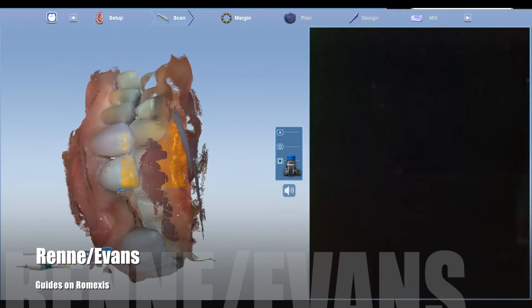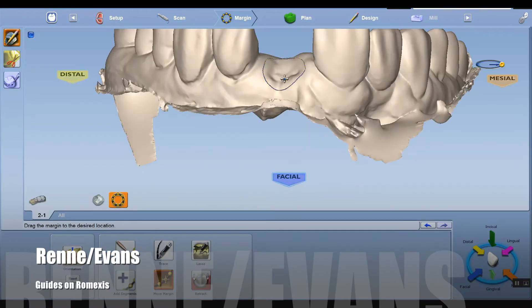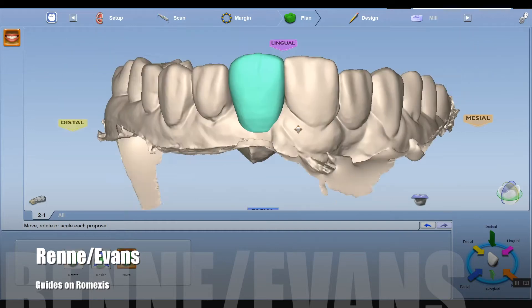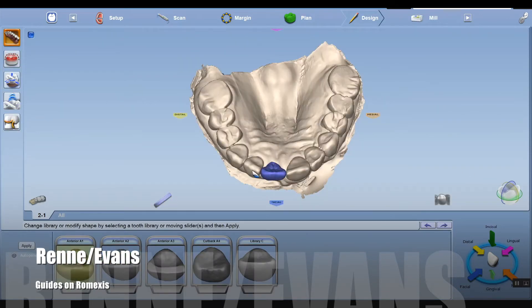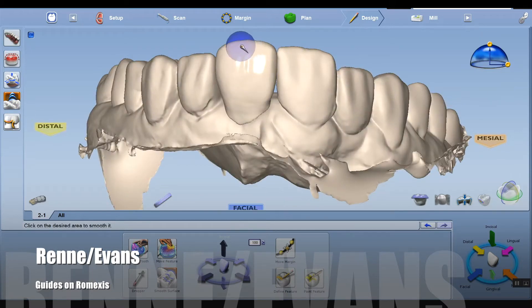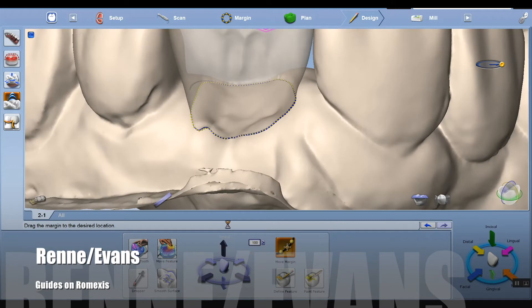You do not do a zigzag pattern on your bite — you scan one arch at a time and allow it to snap into place. Here we're free-handing this wax-up for this tooth using the plan tab and the various tools in PlanCat Easy, which is pretty simple.